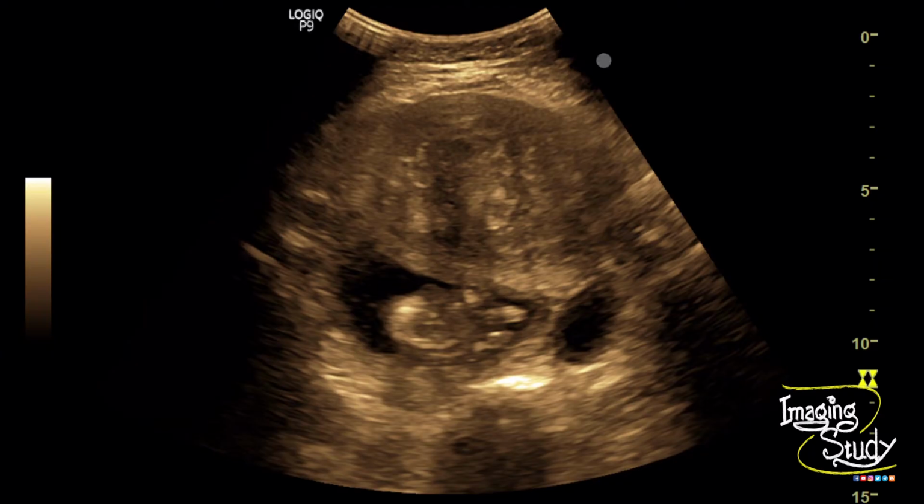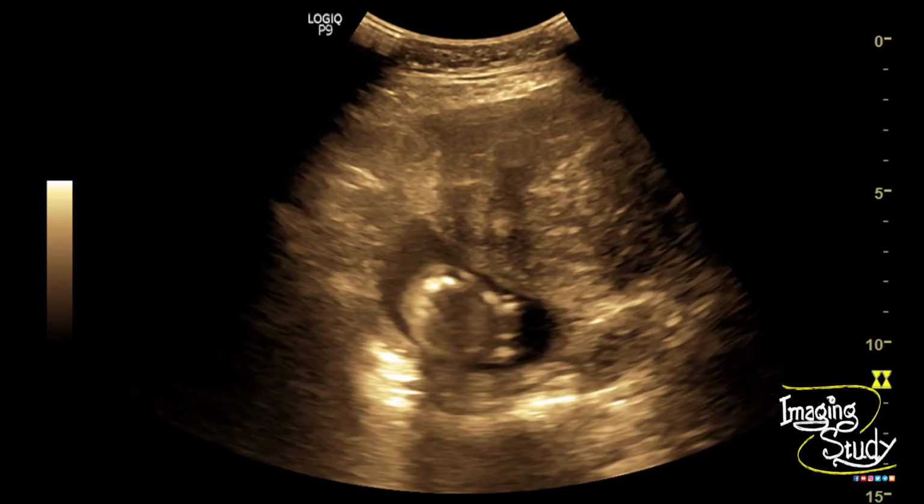So here's the picture of the fibroid arising from the anterior myometrium, causing compression over the gestational sac and also causing irregularity of the perimetrium. This fibroid is causing compression over the gestational sac. So will the fetus survive this compression? The time will say more.